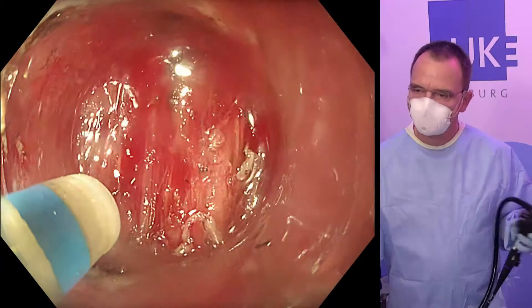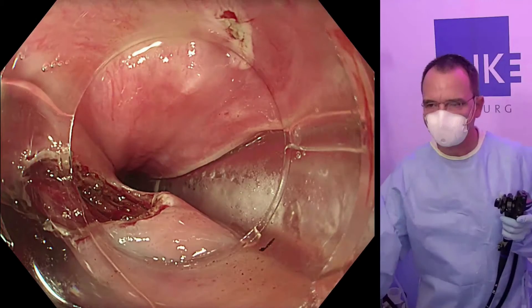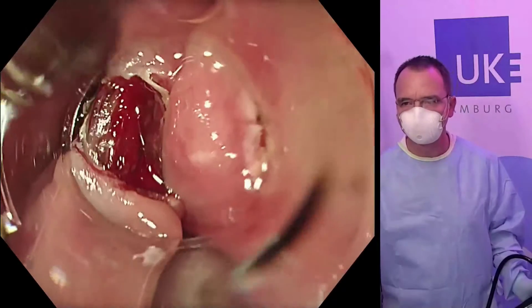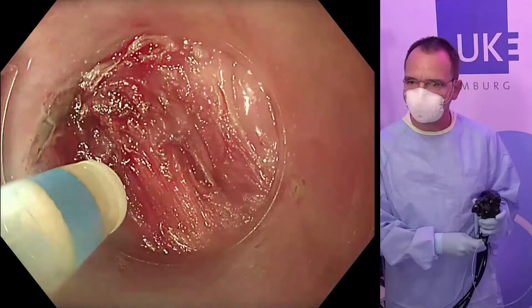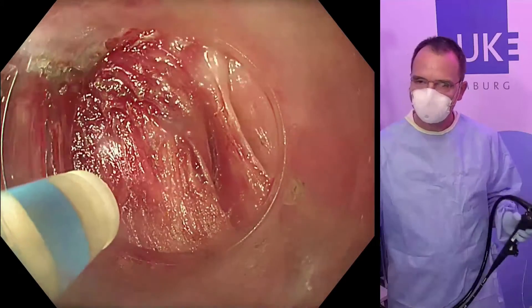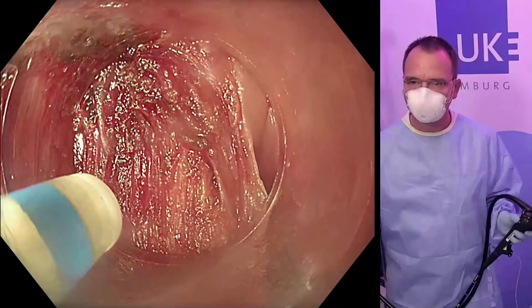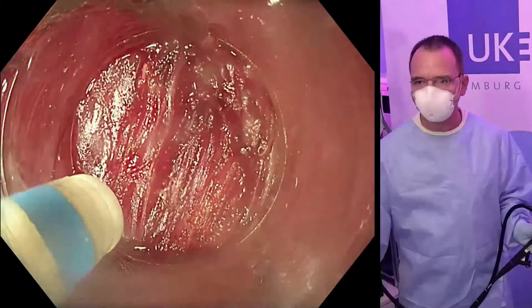Here we have the perspective on the anatomy: the gastric tube on the right side and a direct view onto the muscular septum. This is a rather broad muscularis of the cricopharyngeal muscle, also known as the inferior constrictor muscle.